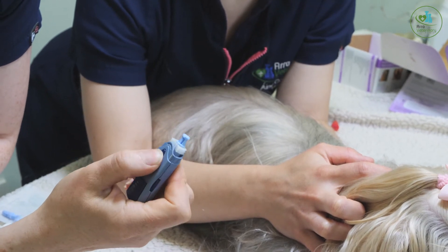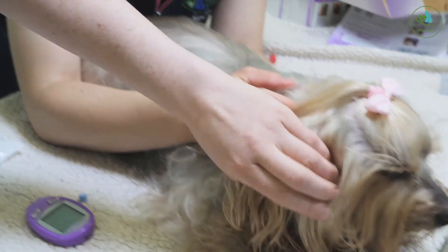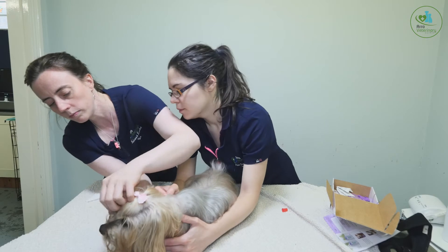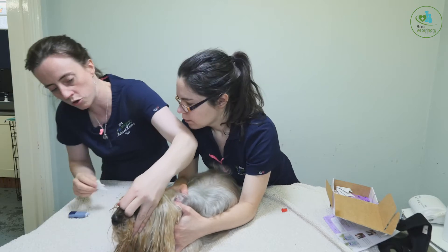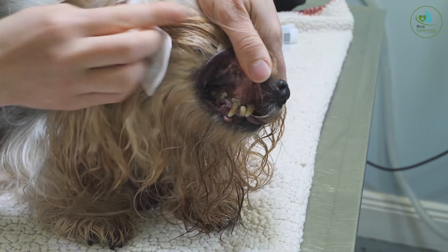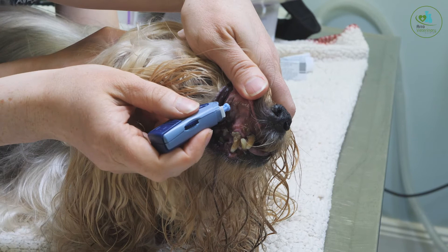There are two spots to take the sample from. The first is on the lip — you lift up the lip nice and carefully like this. Dry off the mouth and remove the saliva so it doesn't dilute your sample, and hold it up like that.